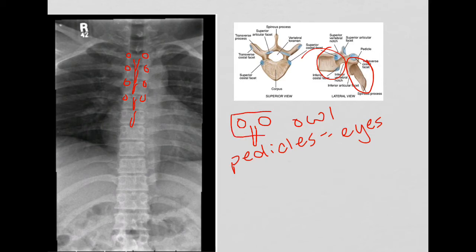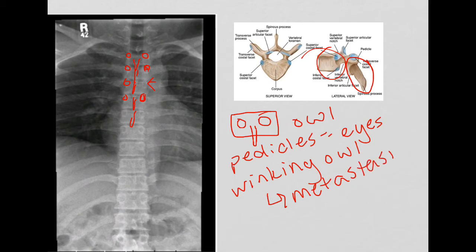So now we've got this cute little owl guy. You'll also notice in some patients, hopefully not many, but you may run across this from time to time, that a pedicle or an eye is missing. If you see this, this is often referred to as the winking owl. And this is an indication sometimes of metastasis along the spinal canal. Just a little fun side note.